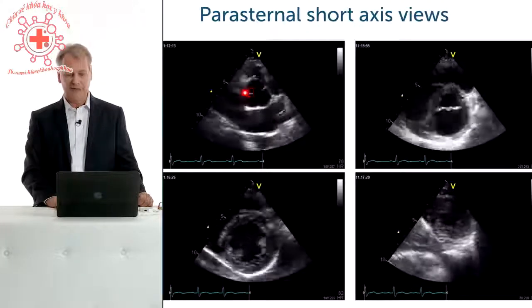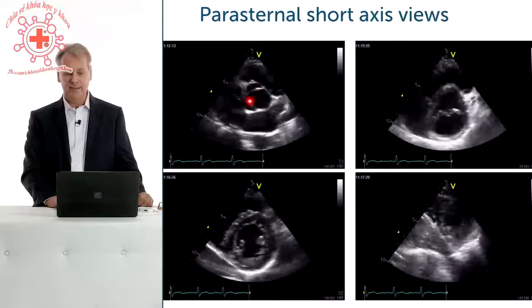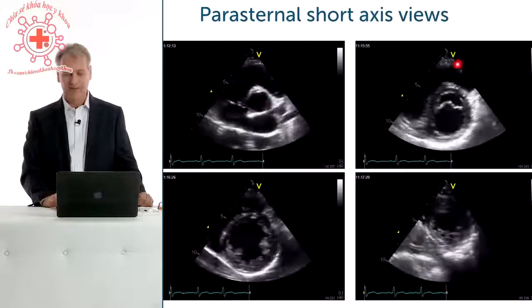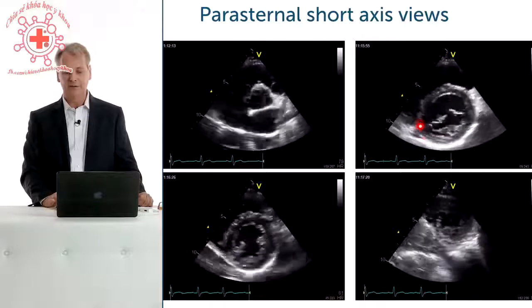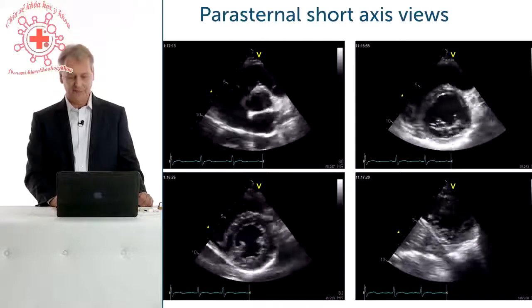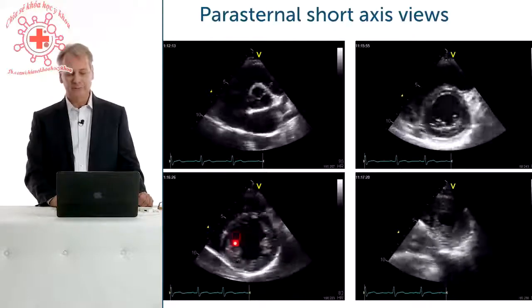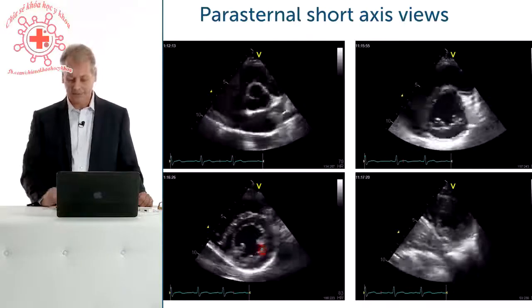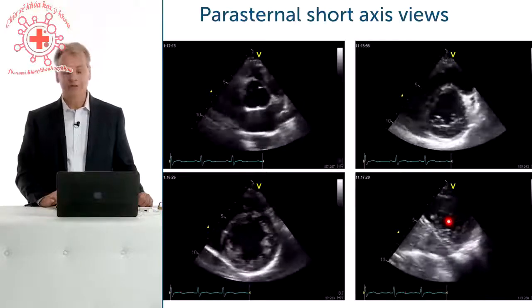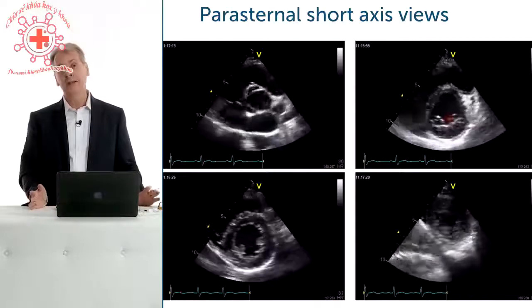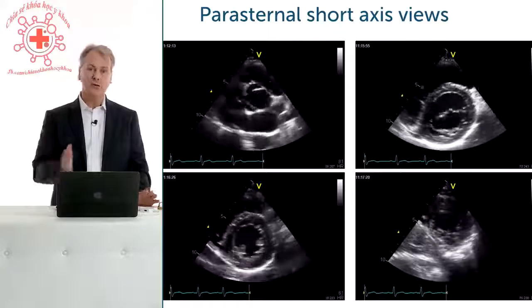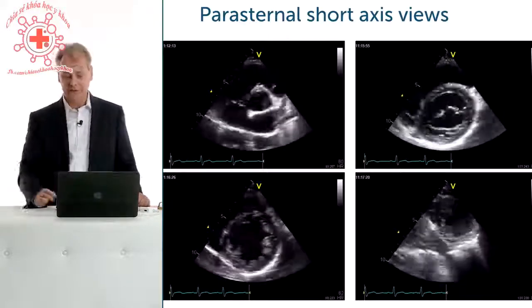To summarize the parasternal short axis view: if we scan from cranial to caudal, we get the base with the aortic valve in the center, then at the level of the mitral valve the typical fish mouth appearance of the anterior and posterior leaflets, then the left ventricle at the level of the subvalvular apparatus and papillary muscles, and finally the view at the apex. Don't forget that there are many views in between, and it's advisable not only to look at the standard views but to scan through the entire heart. This basically summarizes the parasternal window. In the next chapters we'll look at another very important window — the apical window.